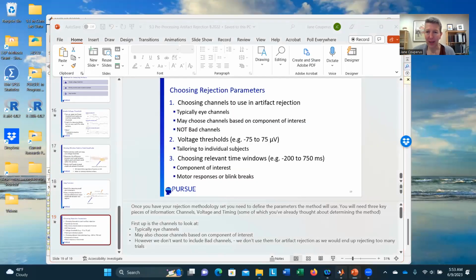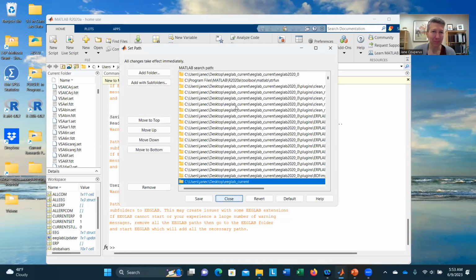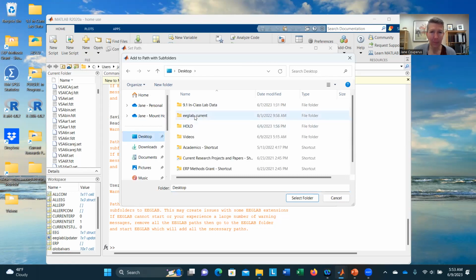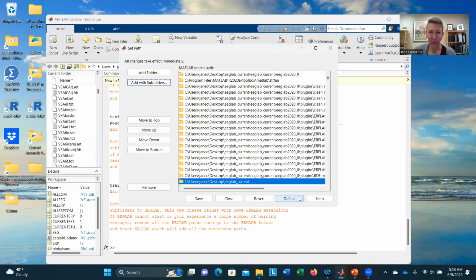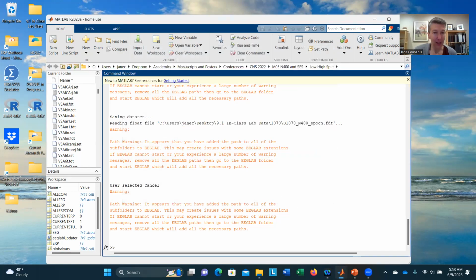So moving on, practicalities. All right, so we're going to go back to MATLAB. I'm going to quickly pretend I'm starting fresh for the day, and I'm going to set my path. I'm going to add with subfolders where my plugins are for EEGLAB, ERPLAB. And again, I'm adding with subfolders. Go ahead and close that if you have to do that. And then I'm going to bring up EEGLAB.